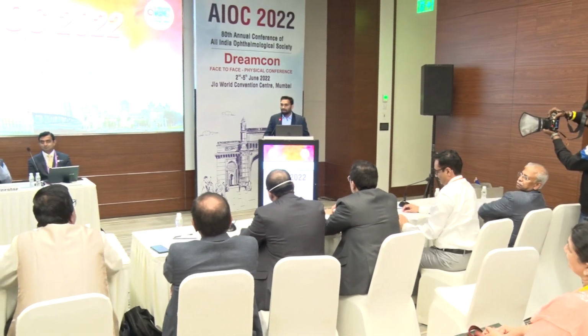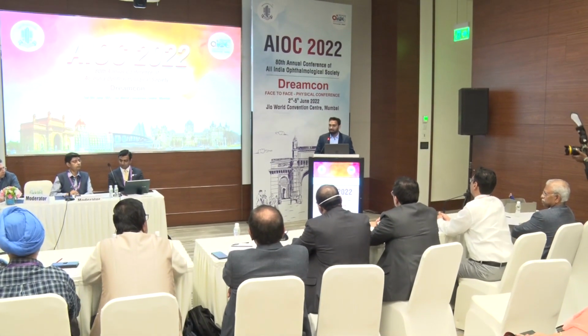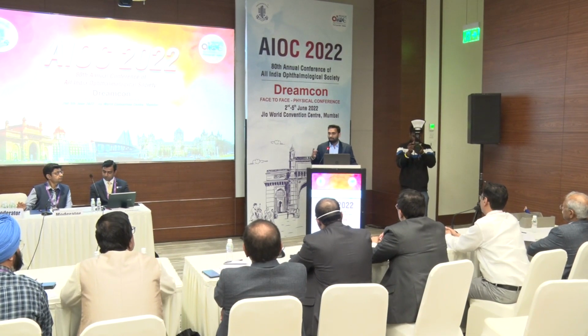How long you can keep these IOLs? Unless and until there are some artifacts coming in those IOLs, we can actually use it numerous times. In your experience, how long have you used? The IOL which I used over here had 4 IOLs together, but with Aurolab we have been able to get one single IOL with 120 diopters power. I've been using it for 1.5 years.